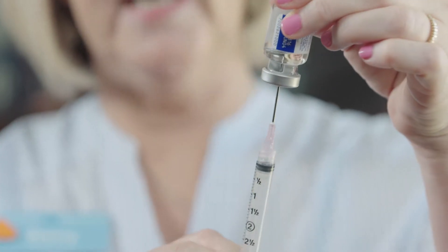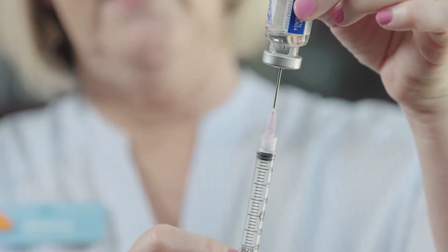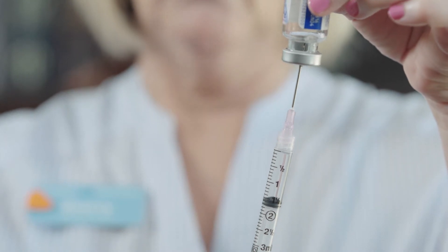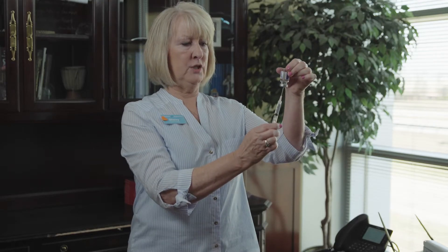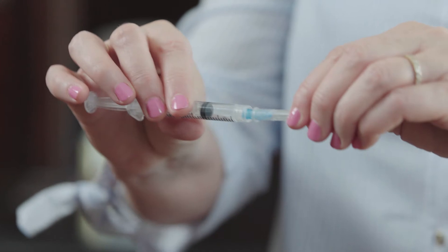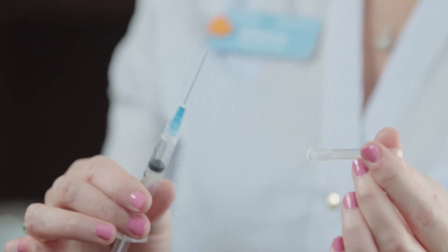You will want to pull down on the needle to make sure it is in the u-shaped cutout of the rubber, then pull down on the plunger to pull everything back into your syringe — one and one half ml, which is equivalent to ten thousand units of Pregnel. Once you have the medication pulled into the syringe, turn the vial over. Recap your needle carefully, unscrew it and discard it, and place your injecting needle on. It is still an inch and a half long to reach the muscle, but it is much thinner than the mixing needle. Now you are ready for your injection.